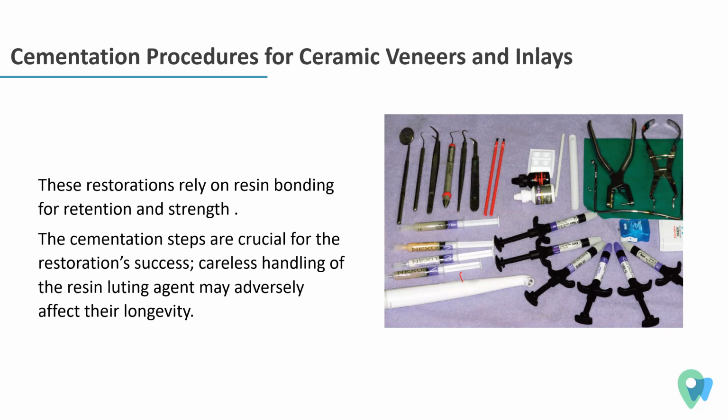On the other hand, for ceramic veneers and inlays, these restorations rely on resin bonding for retention and strength. The cementation steps are crucial for the restoration's success. Careless handling of the resin luting agent may adversely affect their longevity.